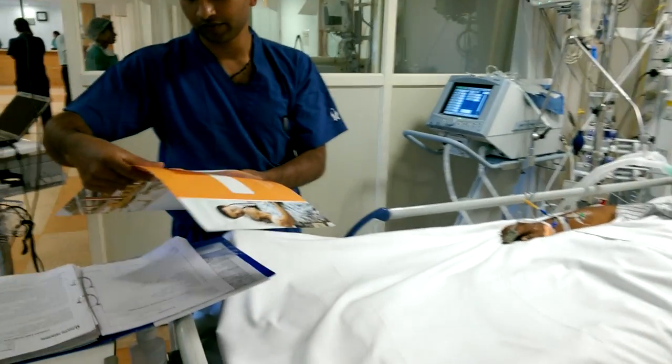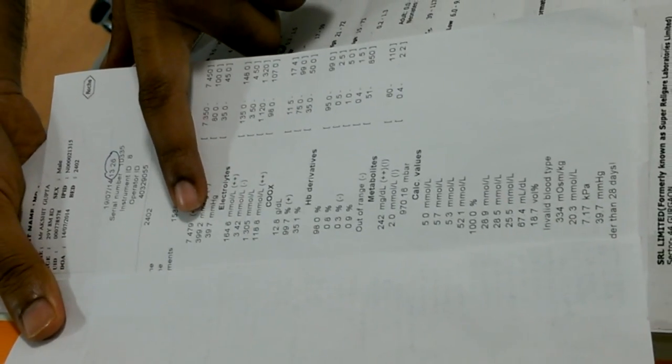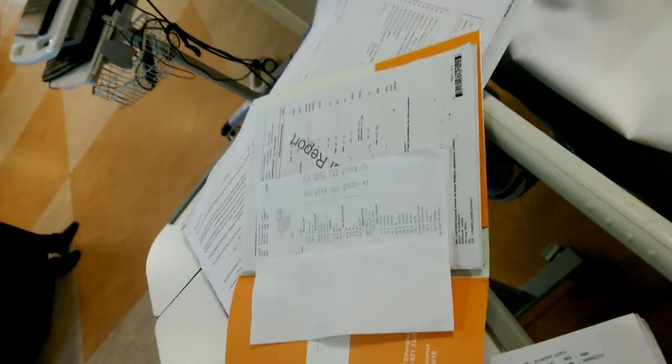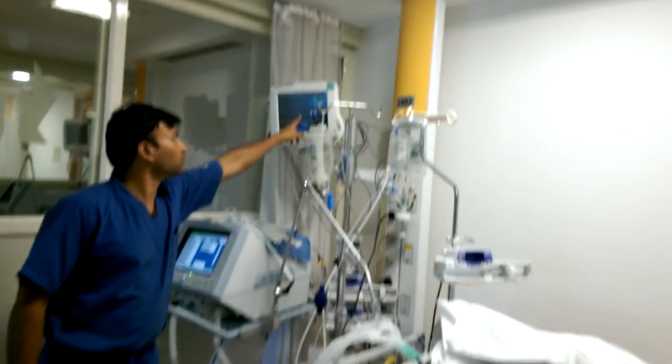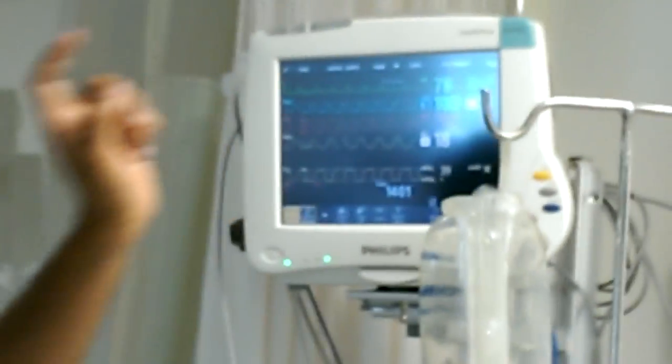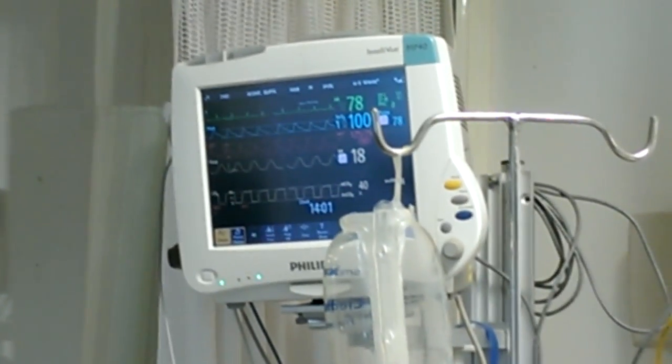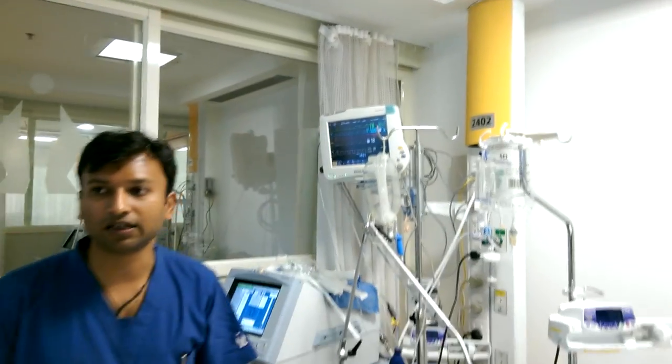As you can see, this is the baseline ABG, and you can see that the CO2s are normal. Pre-oxygenated oxygen is almost 399. Blood pressure without inotropes is 124/74. So this patient is fit for the apnea test, and we can start the apnea test.